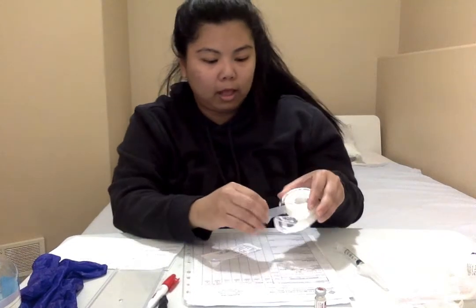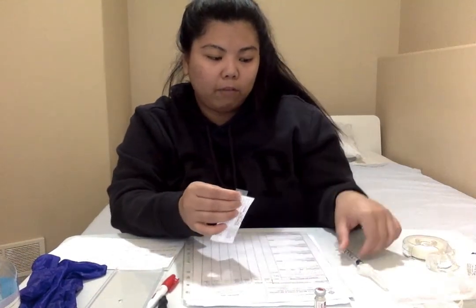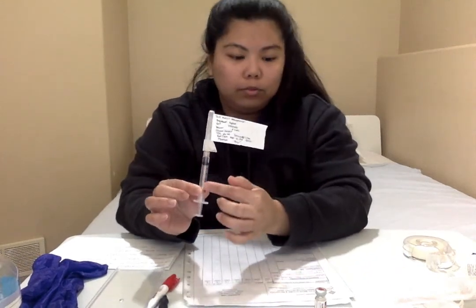And then we want to label our medication right away. We're going to stick this onto the cap of the needle, so just to make sure that we can still get a good view of the markings on the syringe. So then now we're going to perform our second medication check.